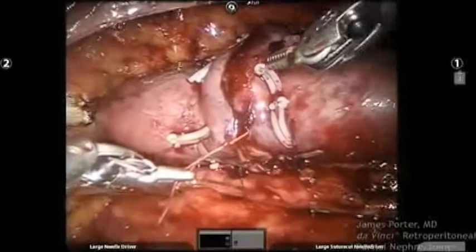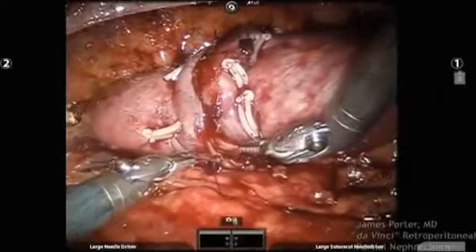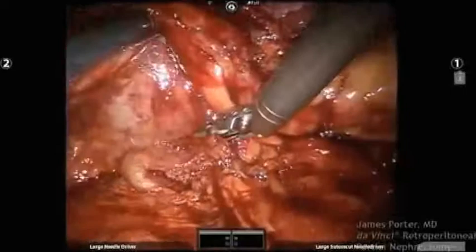So if you guys don't mind, what time do we have? We've got some time. We're going to extract. We're just going to put some Floseal on here, and we'll let you guys go, I guess. Any other questions? Let's get this out of here, Nance. It's a beautiful case.